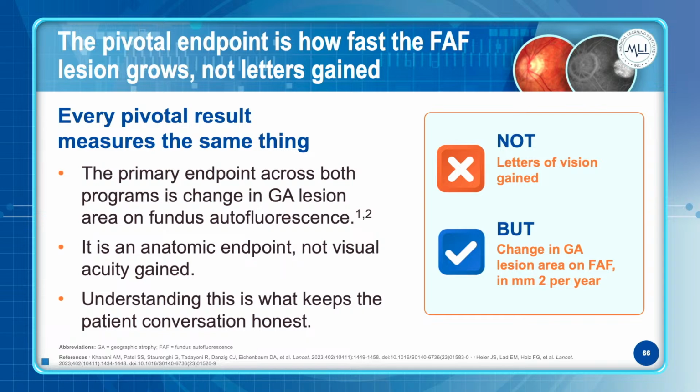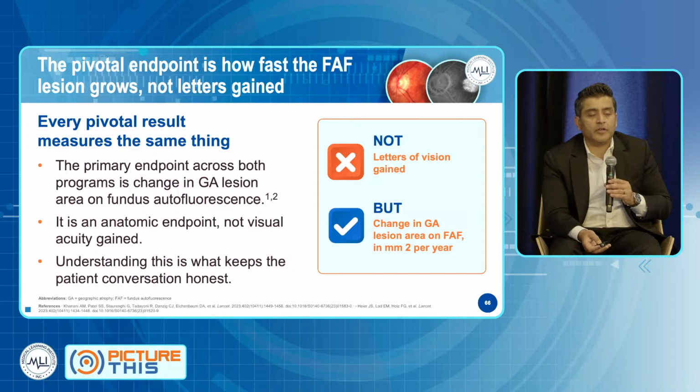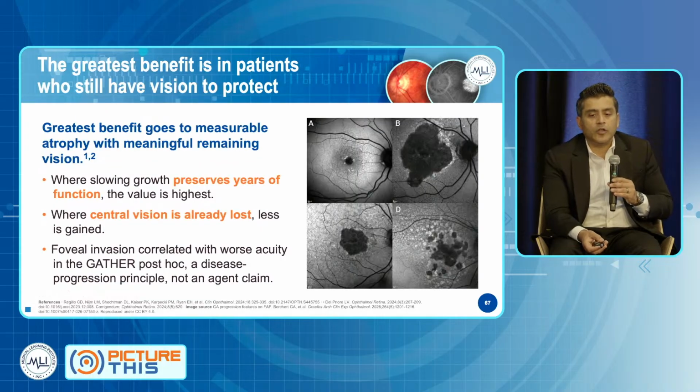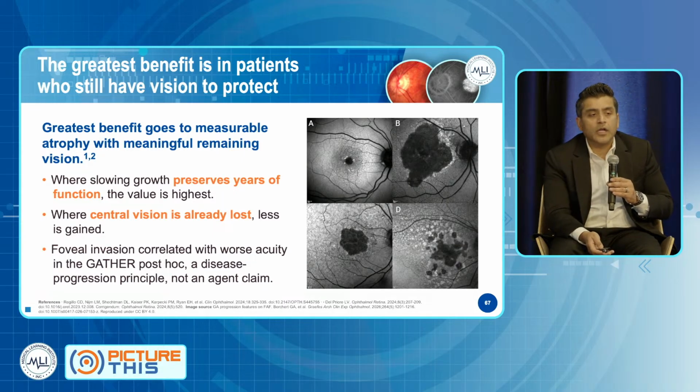So when I'm treating a patient in clinic, because BCVA is so variable and we are doing Snellen, I'm actually looking at the OCT images to see how they're doing. My hope is that we're able to show, and there's a lot of artificial intelligence and other tools now, the trajectory before treatment and then show them the slowdown of the trajectory after treatment.